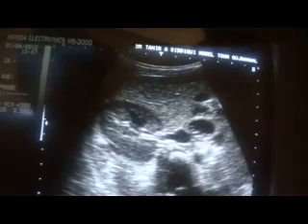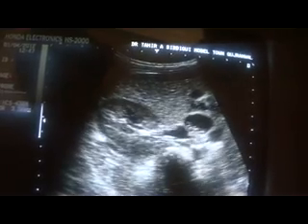When you have to see the portal vein in total, everyone should see it for the evaluation of the gallbladder, especially as it is a landmark for the identification of the gallbladder.